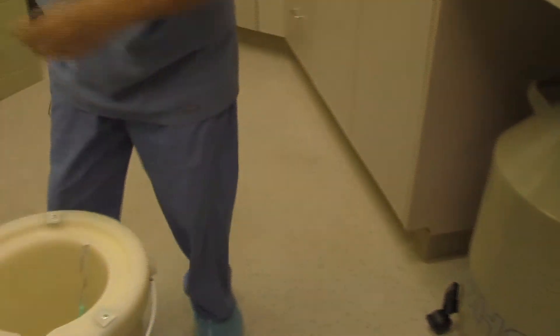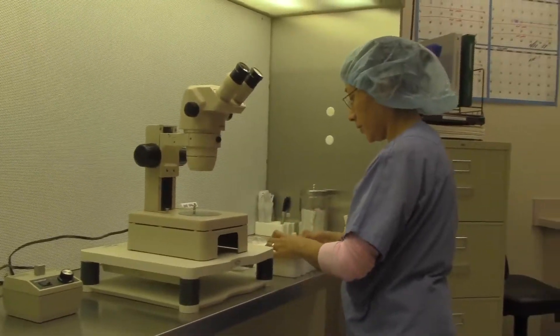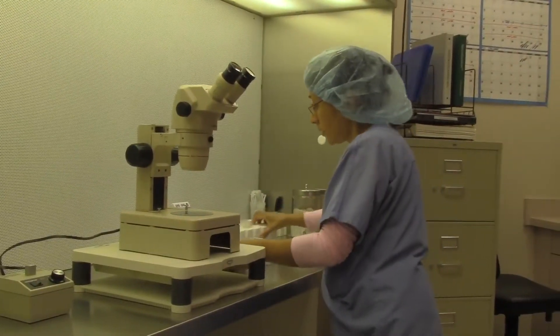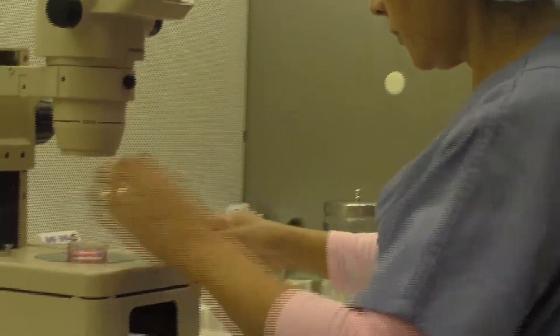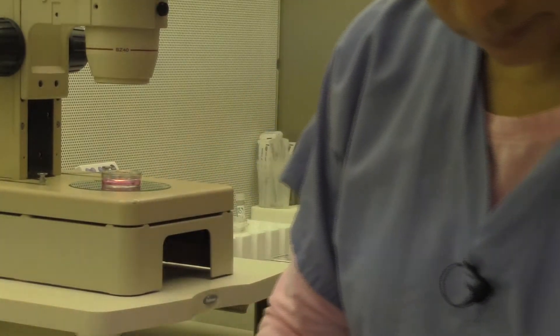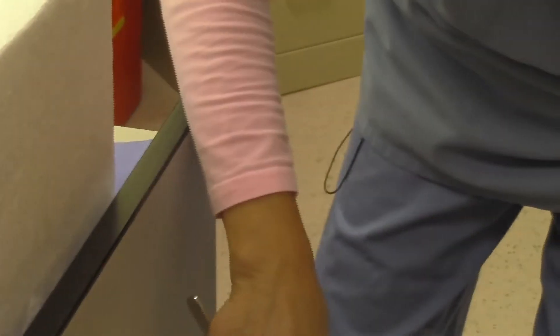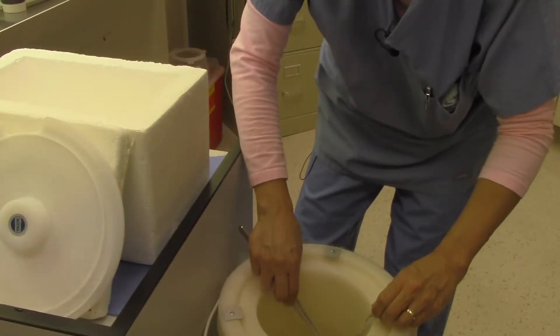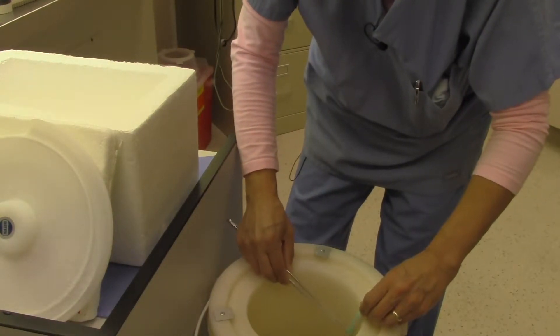The thawing process is a little bit different but just as important as the freezing process. It is a total of seven steps. We double-check the patient's name versus the patient being thawed, and double-check the straw when we pull it out — confirming the proper patient's name, social security number, or the egg donor being used for the patient.